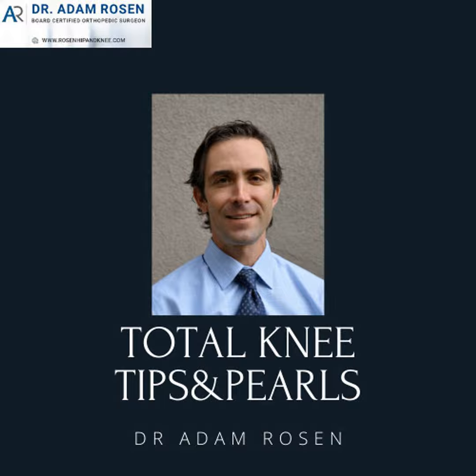So it's very useful to get the fluid just prior to making the arthrotomy, aspirate the knee, send it off for cell count. Always send it off for crystals. Always send it off for culture, aerobic, anaerobic, holding for 14 days so you can look for P. acnes. And if you are concerned, AFB and fungus. I routinely send all 4 just because I've seen some weird things over the years. We get a lot of weird referrals, so I always make sure that I rule those things out. So that's my fluid sample.